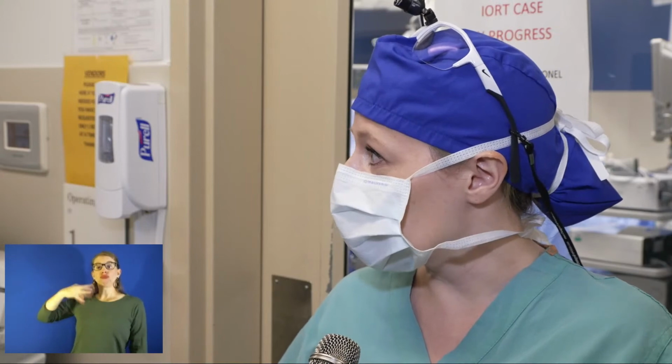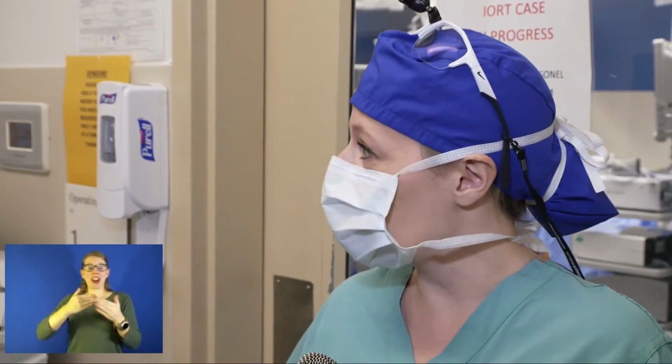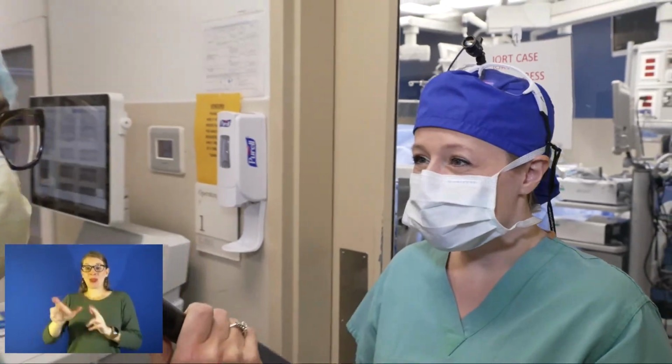And now we've finished with the lumpectomy portion of the surgery and put the radiation applicator in the cavity. So over next to us, you see that they're making sure the equipment is working and they're entering the prescription for us. And then they're going to go ahead and start the radiation treatment once that prescription's entered. And I think they're about ready. Okay, we're ready to go.